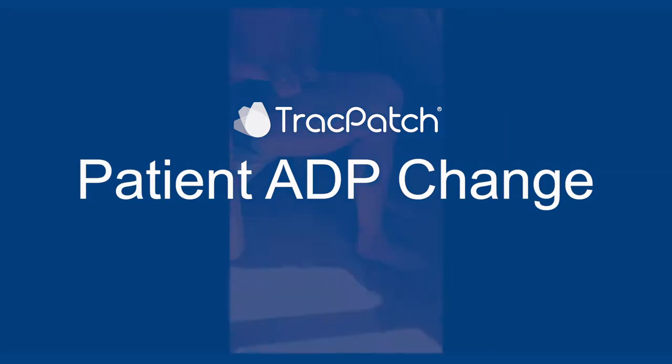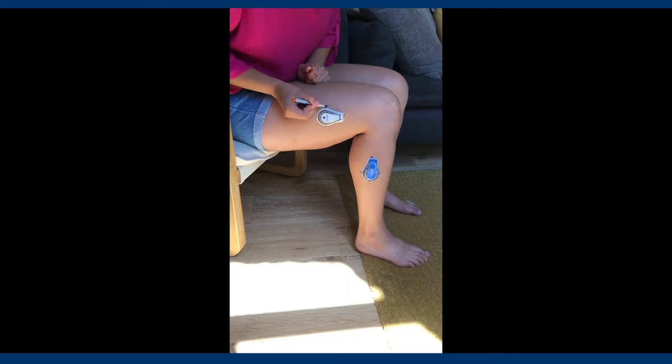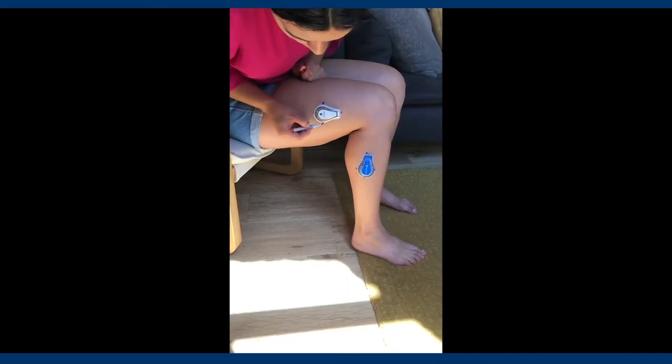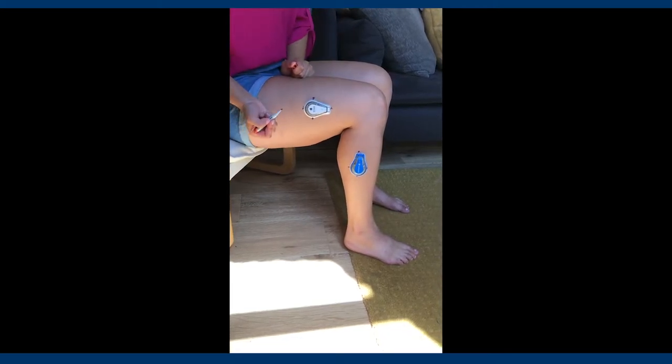Patient ADP Change. You will start by marking your skin where the current ADPs are located. You will use the pen or marker that is provided to you in your track patch assembly kit.